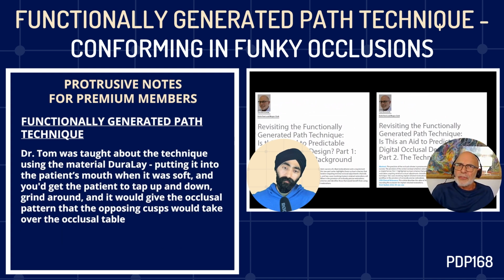And I don't actually even know why we were taught it, but effectively it was using a material, usually in those days it was Duralay. There are other materials today, and you put it into somebody's mouth when it was soft, and you'd get the patient to tap up and down, grind around, and what it would do would give you the occlusal pattern that the opposing cusps would take over the occlusal table.